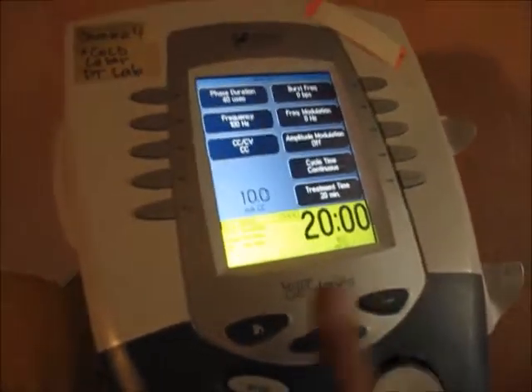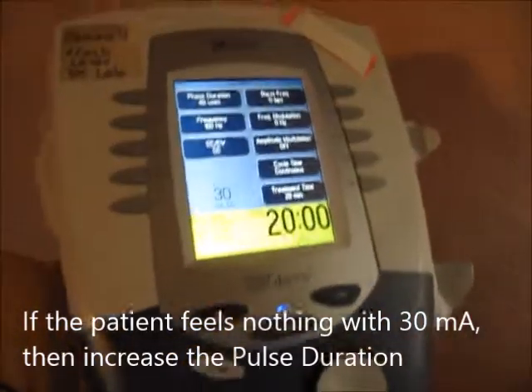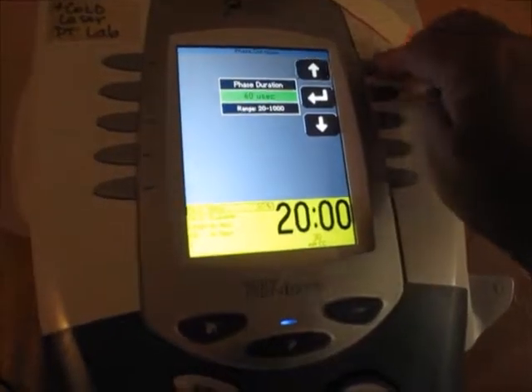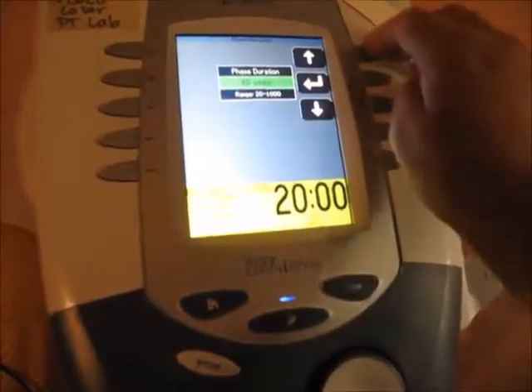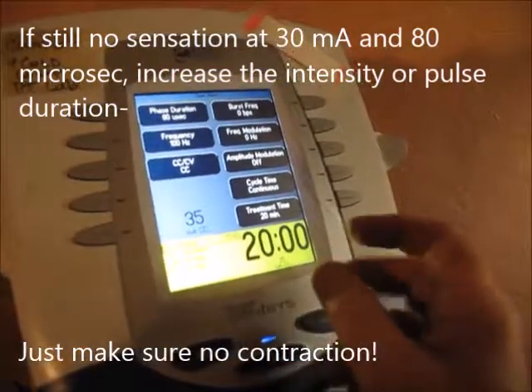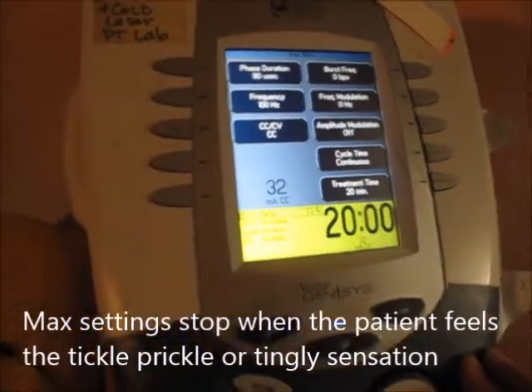There is one stipulation: if you set it to 30 milliamps and the patient doesn't feel any tingling — say they want more Advil but it will cause an ulcer after a knee replacement — go up to the phase duration and increase it. They might feel it a lot just by increasing by 10 microseconds. You can go up to 80 microseconds and increase intensity above 30 milliamps, but only until they get a tickle-prickle sensation. If they get a contraction, even if they can't feel it, do not go above the point where they just get the tickle-prickle.